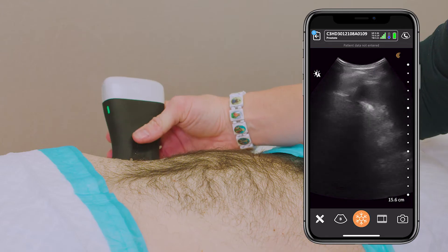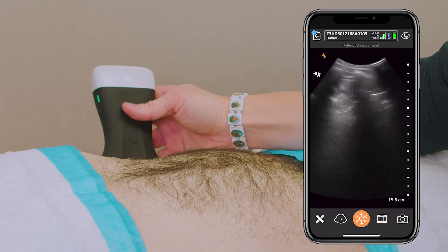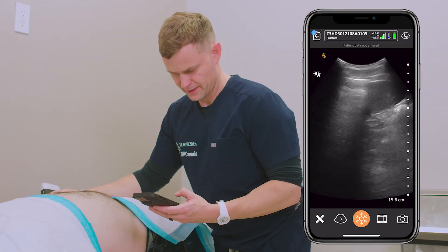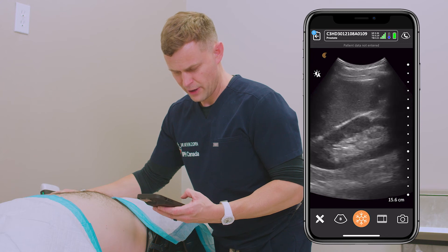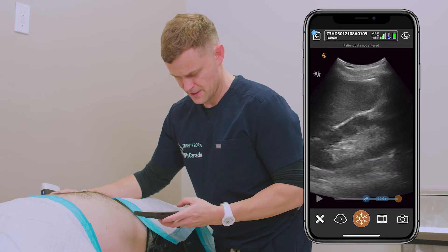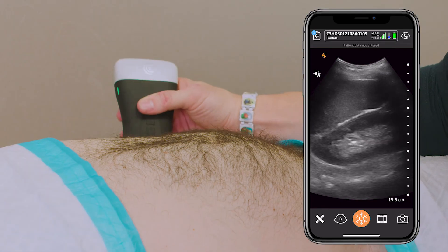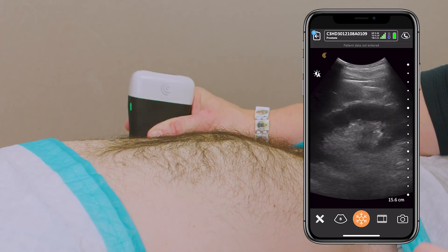Now we'll be looking at the left side. What we're looking to see is the silhouette of the kidney and taking those sagittal and coronal views. There's our kidney — a nice view of that C-structure, nice parenchyma. The central sinus fat looks more white. Looking from lower pole and scrolling up to the upper pole — looks within normal limits. I don't see any evidence of any cysts or stones or hydronephrosis.